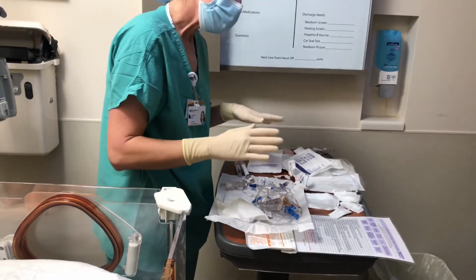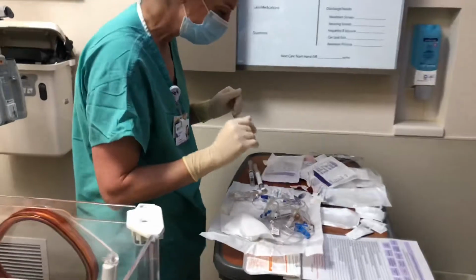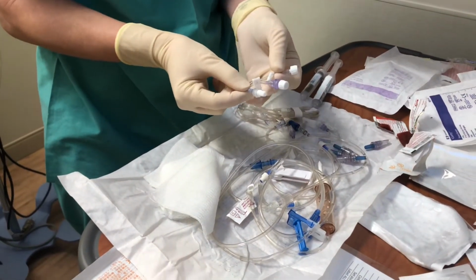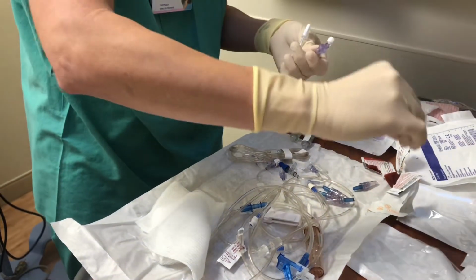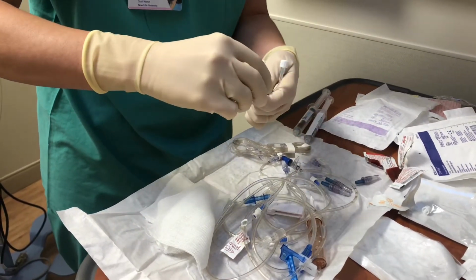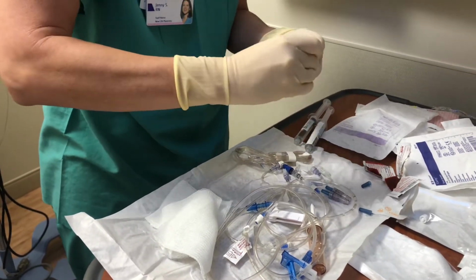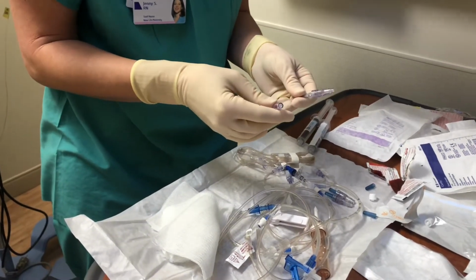Okay, and now at this point, I'm going to assemble my claves onto my Y ports and attach my tubing and my filters. So whatever way works best for you. I think how I like to do it is I'm going to first take that bifuse connector, and we have to put 2 claves on here, although it looks like there's one there. We're going to actually attach, and I can just put my garbage on the side or put it on the field. So this bifuse needs a clave put on both sides there. Okay, so 2 claves are going to go onto that bifuse there.